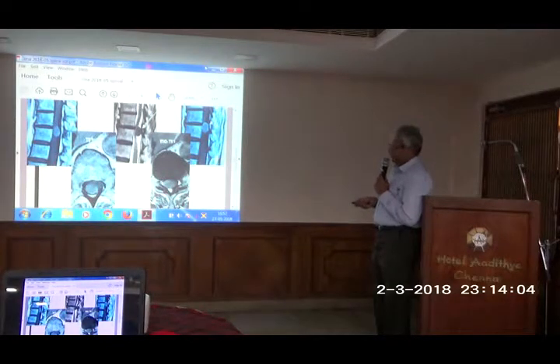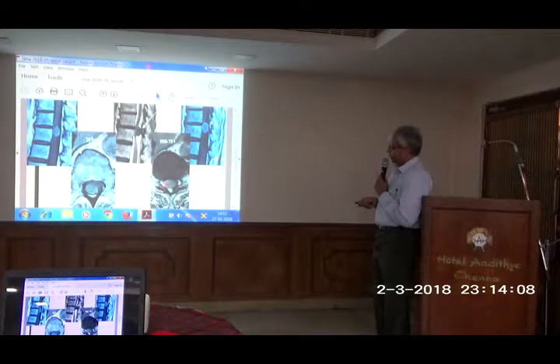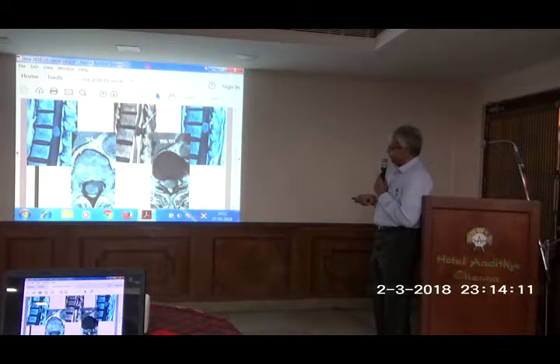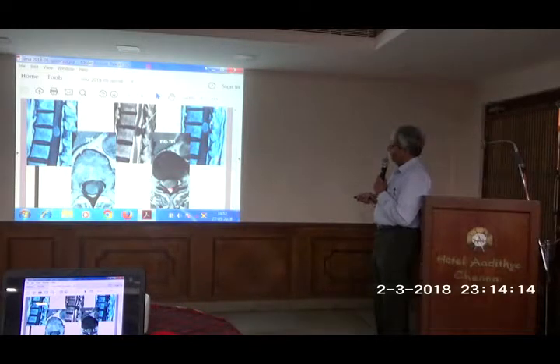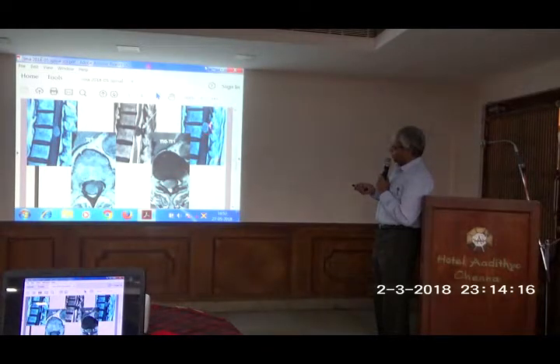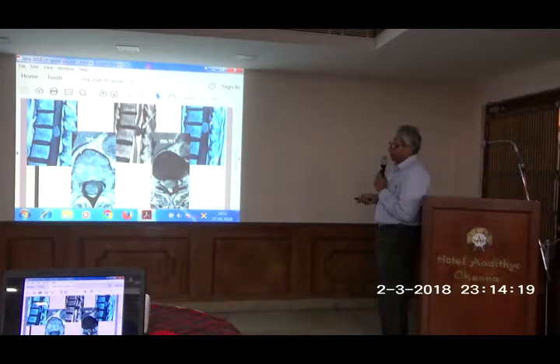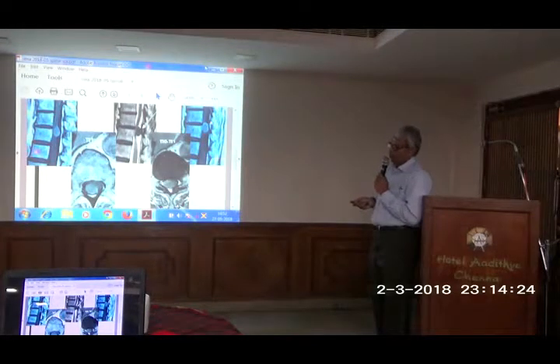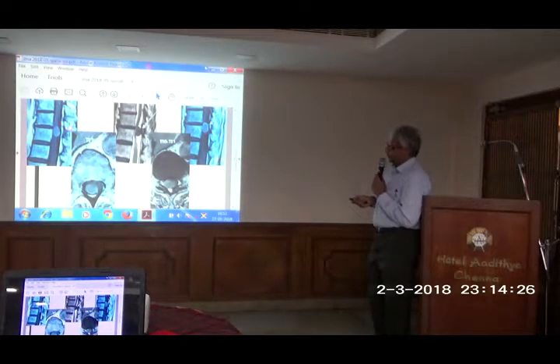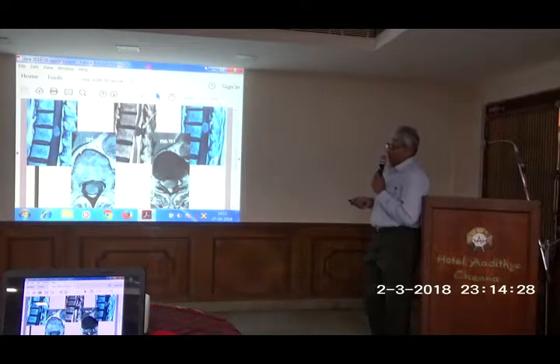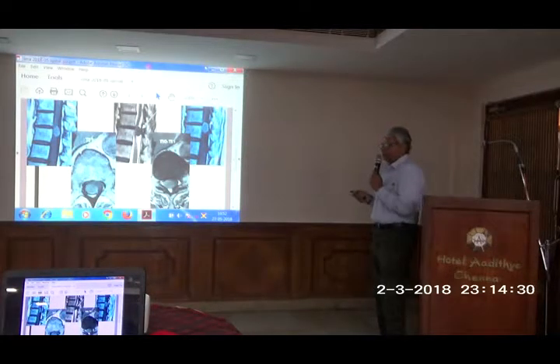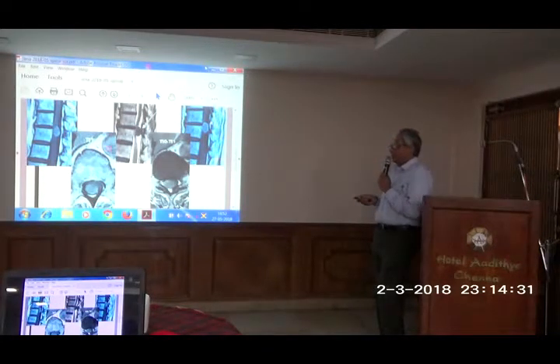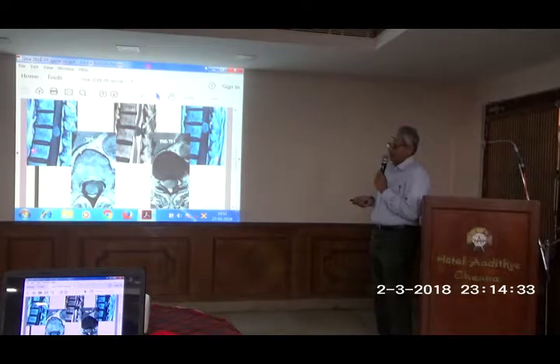In the axial section you have a broad base towards the dura, which is seen only at this level but not at this level. Here you have peripheral enhancement over the superior end. So I thought this was an abnormal presentation of a neurofibroma. With that in mind, by not being mentally prepared to accept that this could be a meningioma, I opened the patient.